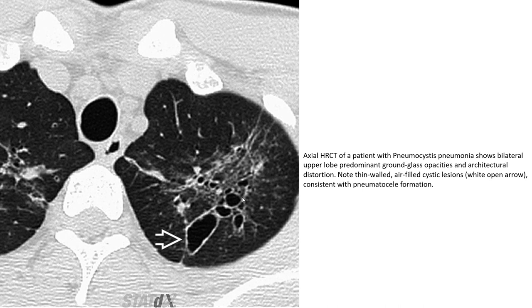On high-resolution CT, bilateral upper lobe predominant ground-glass opacity and architectural distortion with thin-walled air-filled cyst formation is consistent with pneumatocele formation.